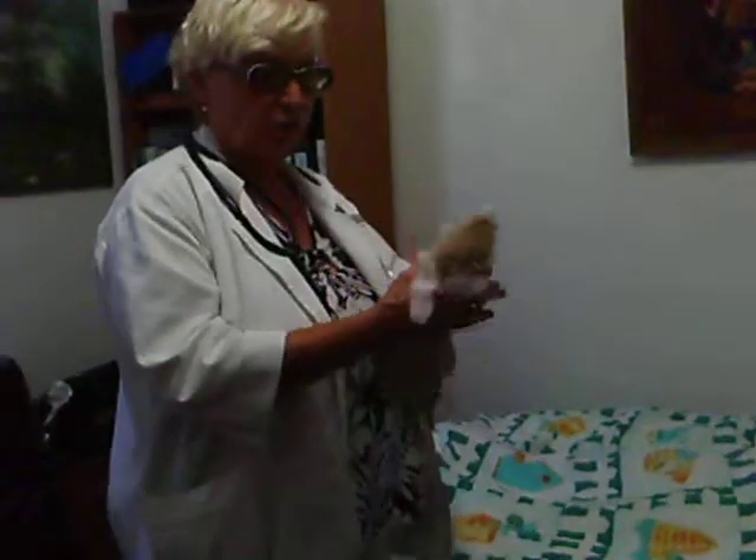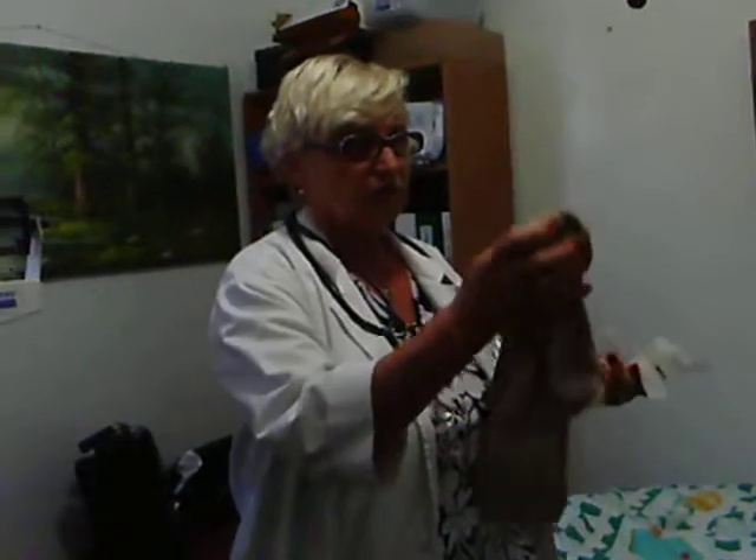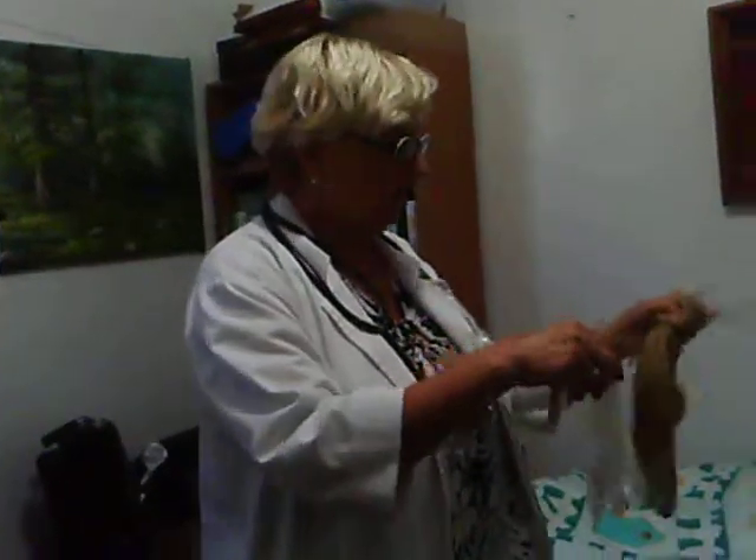I go and grab my supplies. My supplies for the weight are going to be a chair by the scale, non-slip socks, and shoes. Usually students should have a shoe. And gloves — remember, gloves for everything. I come back.